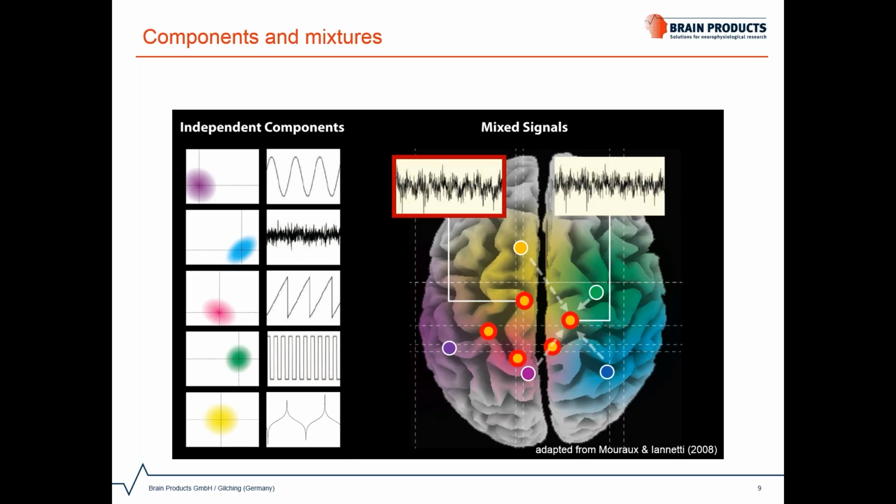Because the signal from the sources propagates throughout the cortex, as the sound would spread on a stage, each of the electrodes records a signal mixture stemming from several sources, including brain activity and noise. Again, for an ICA to be successful, the time courses of the sources need to be independent, and the sources as well as the recording channels need to be stationary.